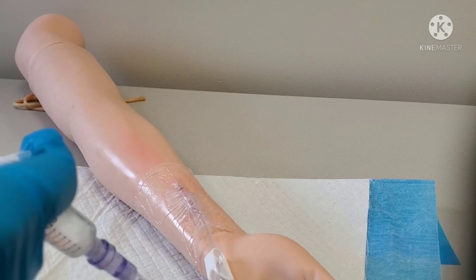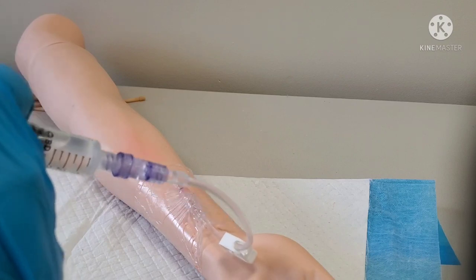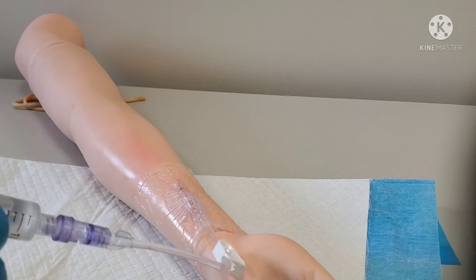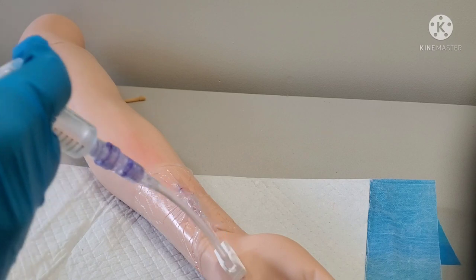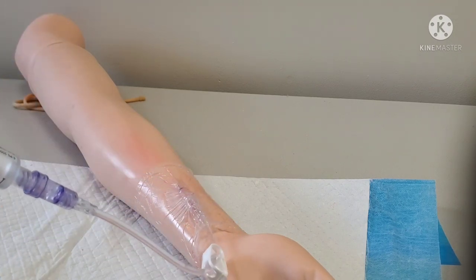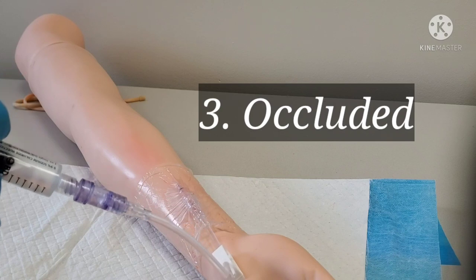Starting my shift, I always flush my IV site and I notice that the IV site is not flushing. I checked my clamp — the clamp is open — and I'm thinking this IV site has become obstructed. Maybe it hasn't been flushed in a while. I'm not going to force it. I'm going to go ahead and start a new IV site, because this IV site is no longer patent.